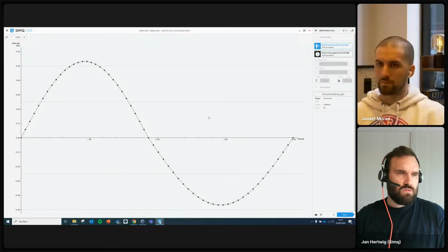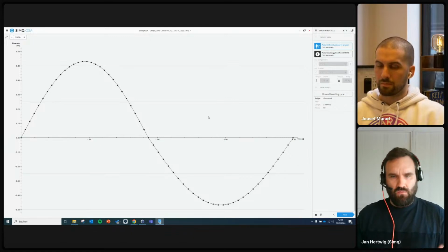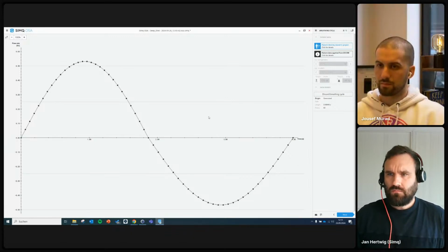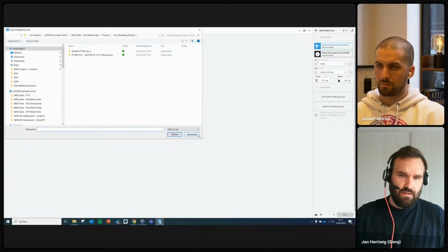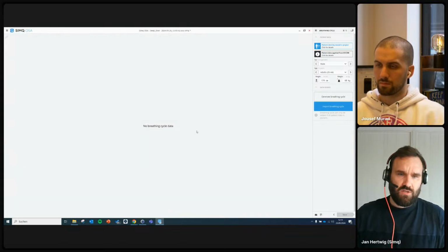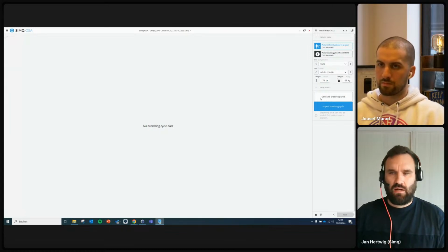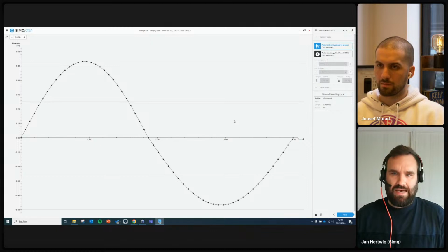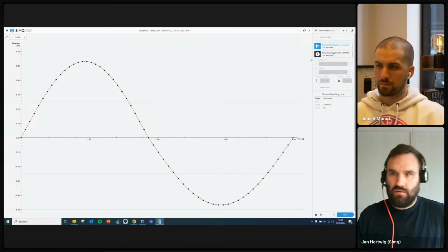And we took those usual clinical approaches and we're putting it into the software. What you also can do is import the breathing cycle. There are also machines that can measure this breathing cycle, but not every clinic has this. So that's why we're giving this standardized breathing cycle dependent on the patient data.